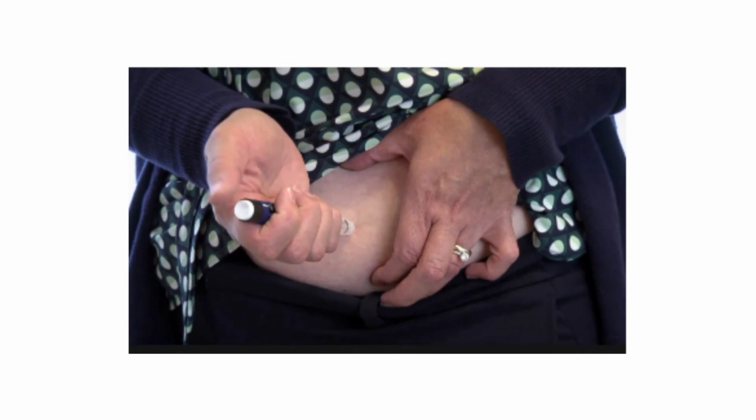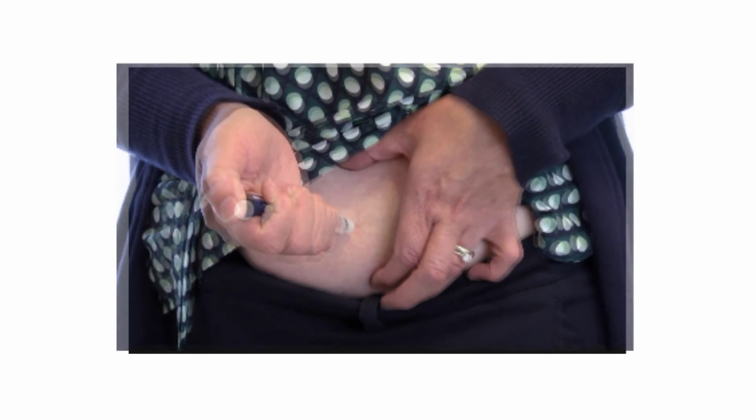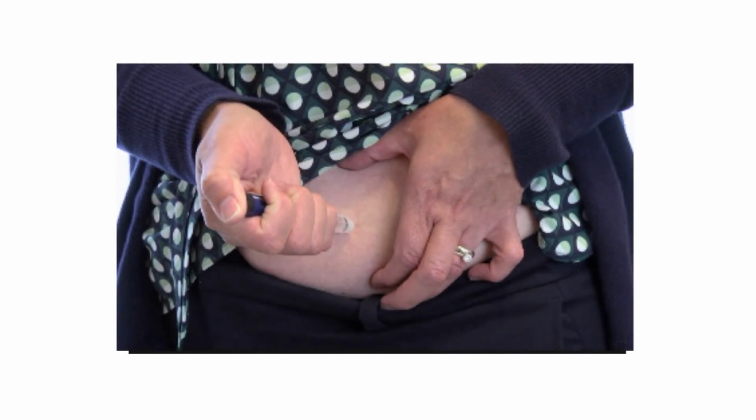Calculate the insulin dose and dial the amount on the pen. With one hand, pinch the skin around the injection spot so that the insulin can enter the body subcutaneously. Use the other hand to hold the pen and firmly insert the needle into your skin. The angle of insertion depends on the needle length and the amount of fat that can be pinched to protect the muscle underneath. Ask the doctor what angle is the best for your body.